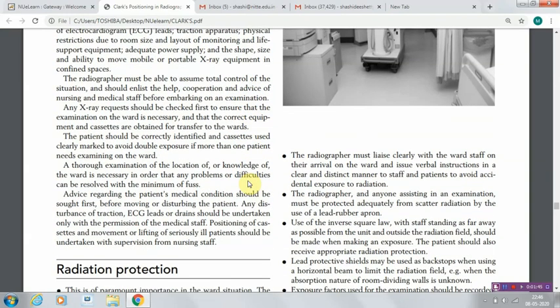So when you take a ward radiography, there are certain necessary steps you need to take. Take an example of when you go for radiography, what precautionary steps you should take by yourself. First of all, when you carry the cassette, you might be taking 2 or 3 X-rays at a time. You should have properly identified the cassette. When you bring it back to the department, you will properly match that cassette to the particular patient.